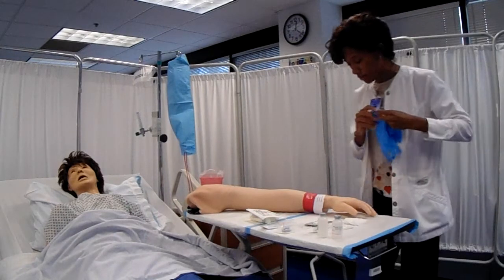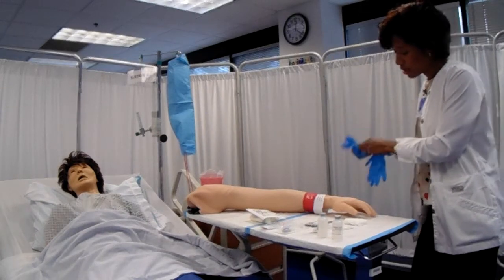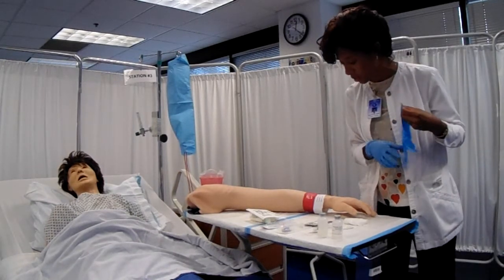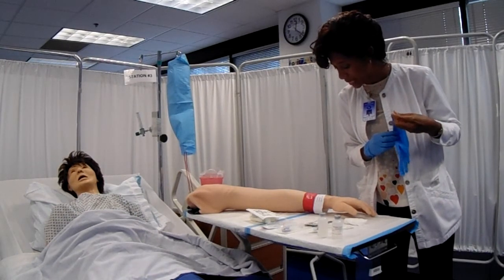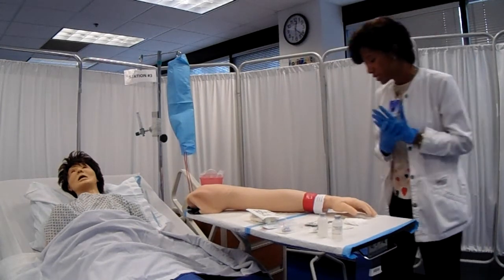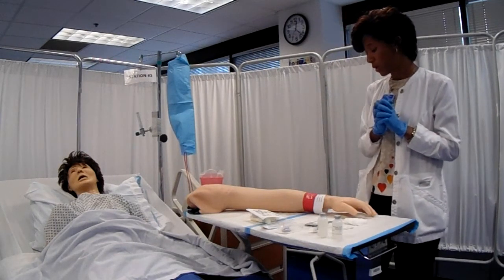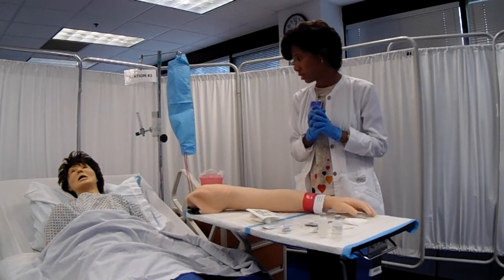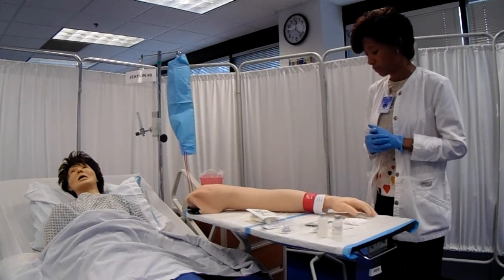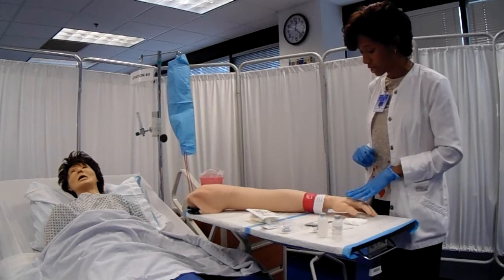Okay, I see here, I can visualize your ID band. Can you tell me your full name? Miley Cyrus. Great. And can you also tell me your date of birth? April 1st, 1990. Very good. Thank you. I see here you have an allergy bracelet on. Can you tell me what you're allergic to? Sulfa? Okay. And what happens to you when you take sulfa? Your throat closes up and you get hives. Okay, thank you very much for verifying all that information. Alright, so I have verified that you are the correct patient based on your patient identifiers.